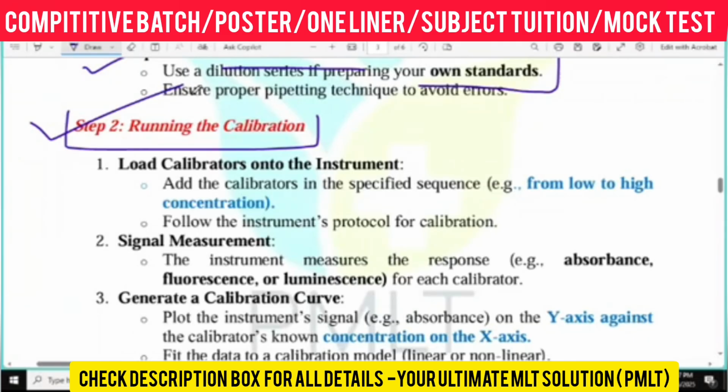See, load the calibrator onto the instrument from low to higher concentration. There might be single-point calibration, dual-point calibration, or multi-point calibration, right? If it's multi-point calibration, then you have to choose the low concentration at first, and after that move gradually to the higher concentration.